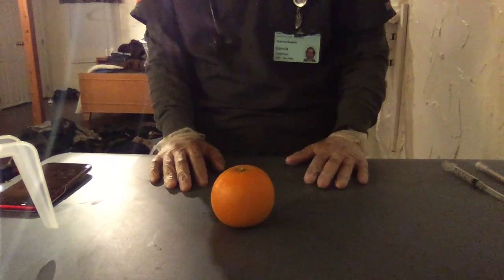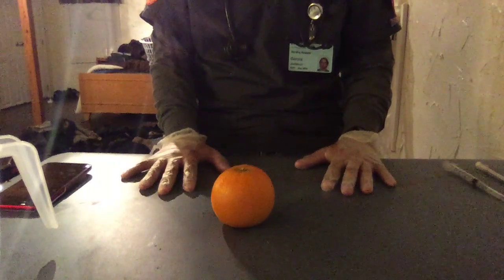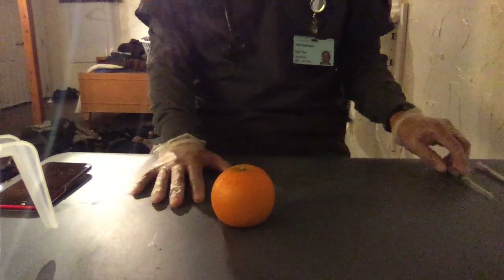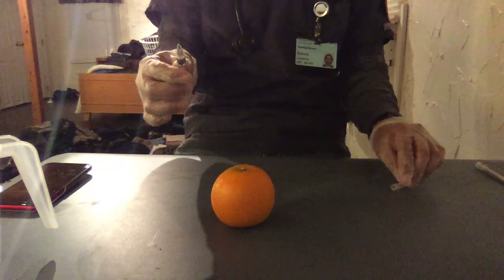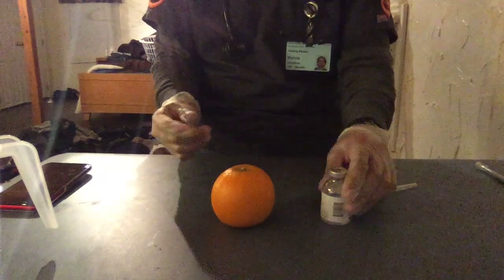Okay, so I did my third check for my medication. I checked my patient. I put her in a prone position. So now we'll do the dorsal gluteal muscle. So I get my first syringe and needle, right gauge, right length. I grab my medication.